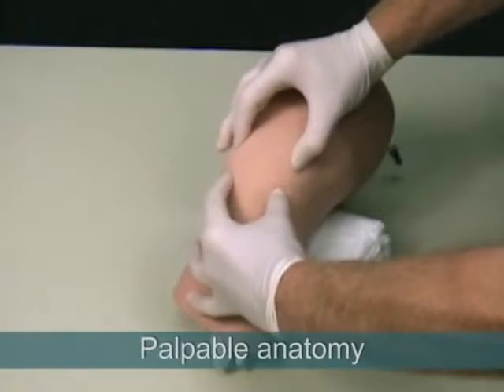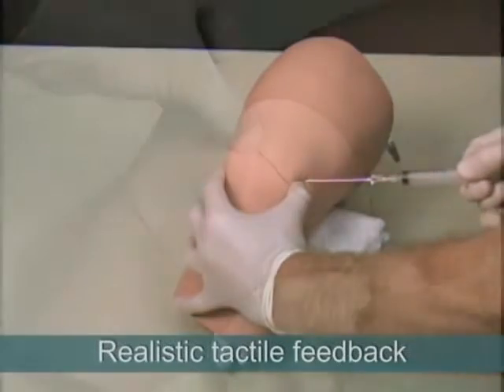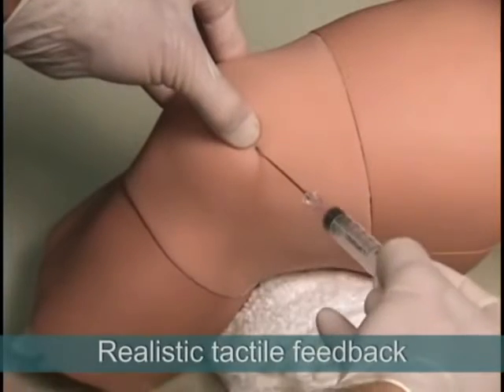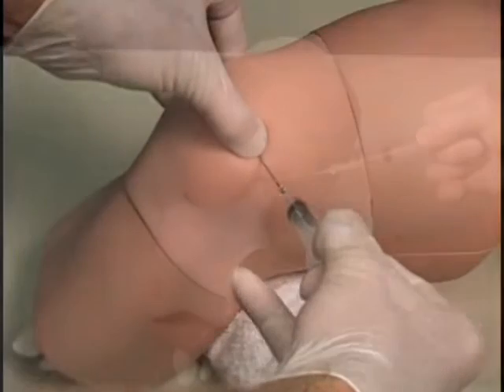During the procedure, the anatomy is palpable and the model provides a realistic needle response. The tactile feedback includes sensation of bony contact if the needle hits the patella or the femur.